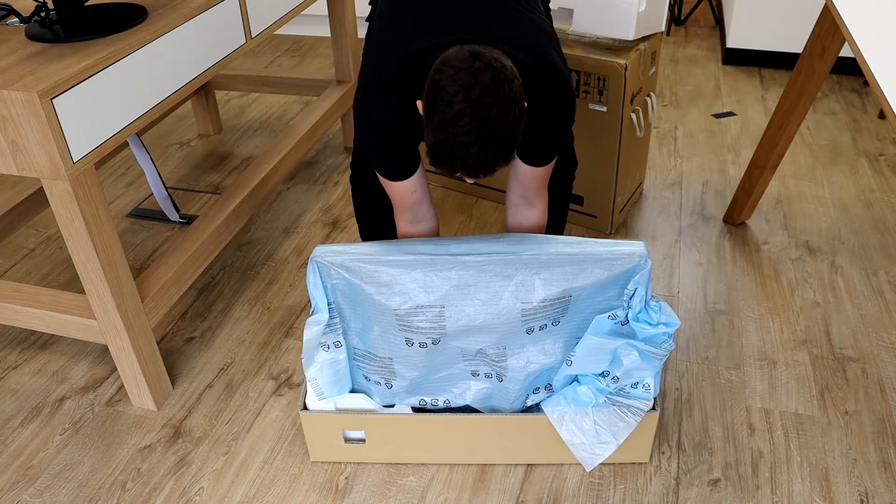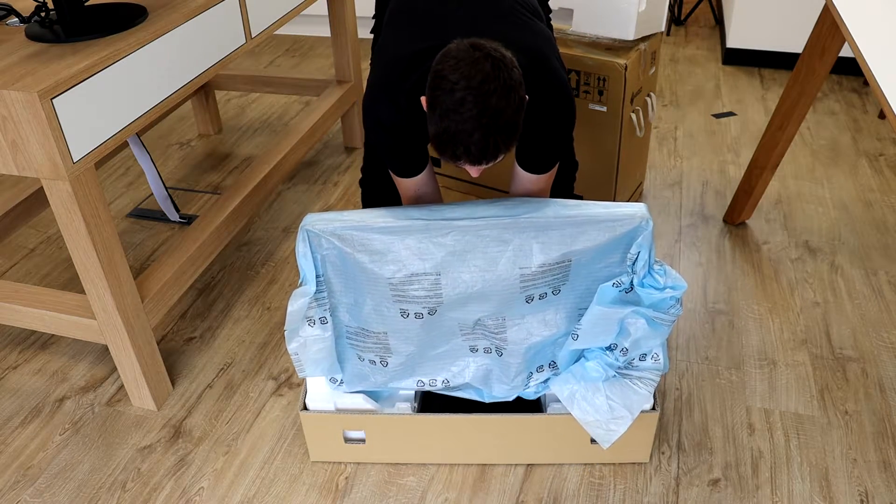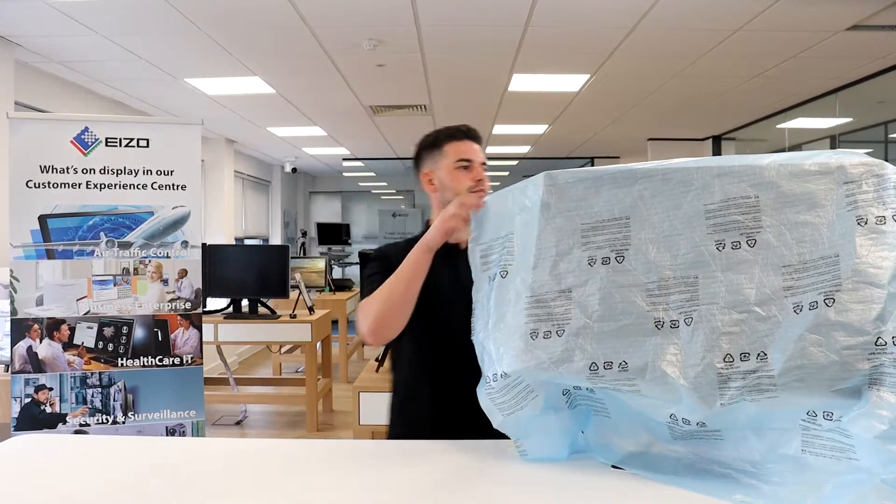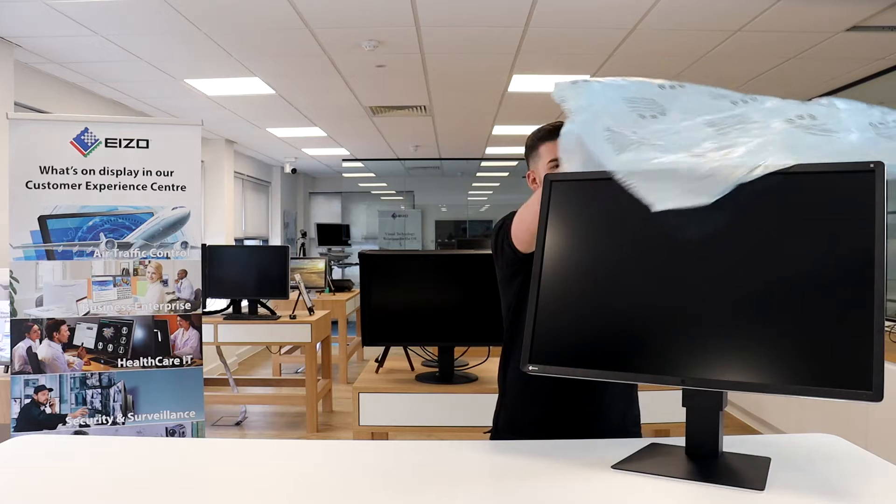Lift the monitor up slightly to enable you to place both hands underneath, and then remove it ensuring no pressure is applied to the LCD panel itself. Then go ahead and remove the protective covering found on the unit.